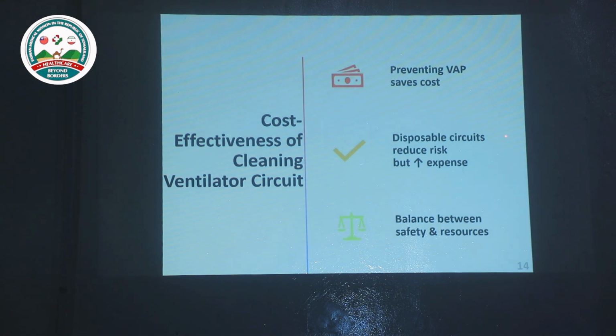Another thing is that sometimes we can use a disposable ventilator circuit to reduce the risk, but this increases expense. Even in Taiwan, we have disposable ventilator circuits, but we also have reusable ventilator circuits to decrease the cost. So we consider the balance between safety and resources. Using the reusable ventilator circuit is, I think, one of the benefits in this hospital.